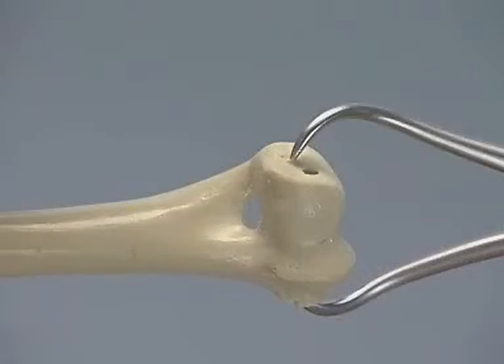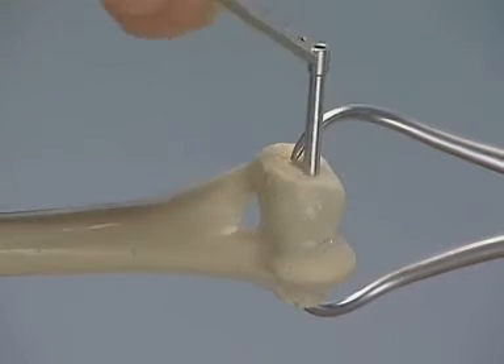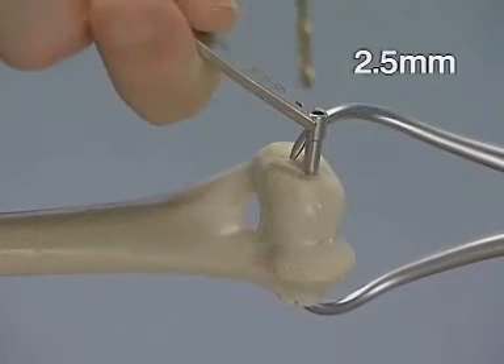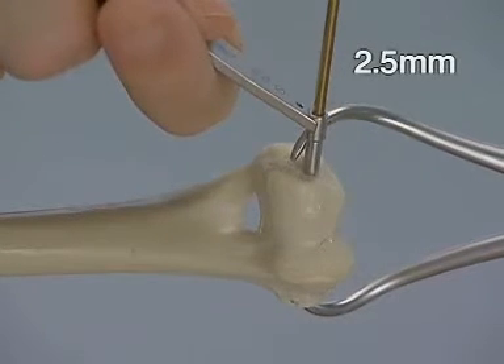The fracture is reduced and held in place with the large pointed reduction forceps. The 2.5 mm end of the double drill sleeve is inserted in the glide hole and the thread hole is drilled with the 2.5 mm drill bit.